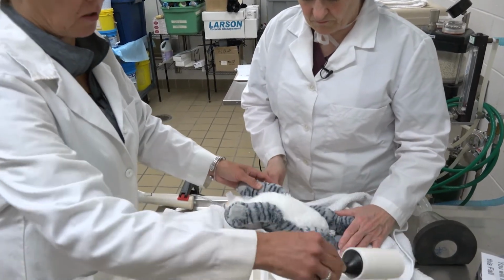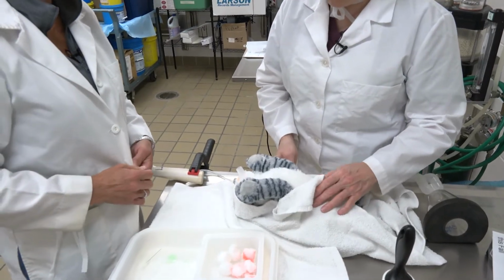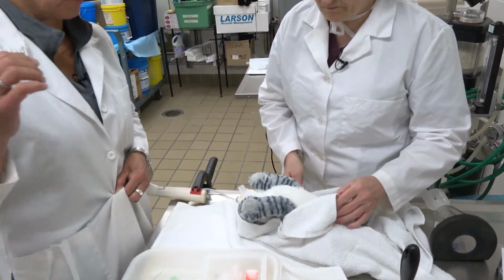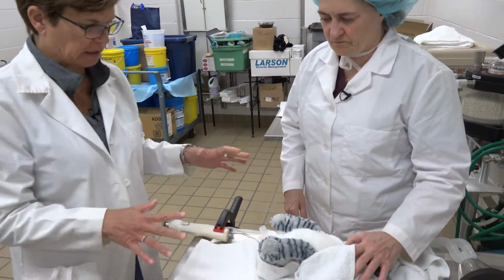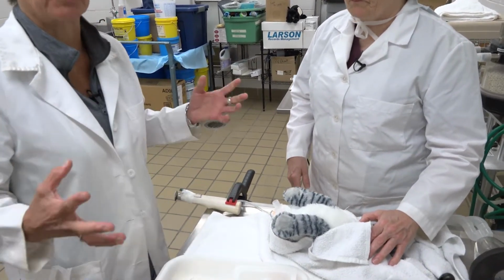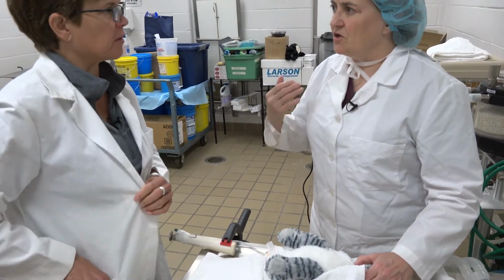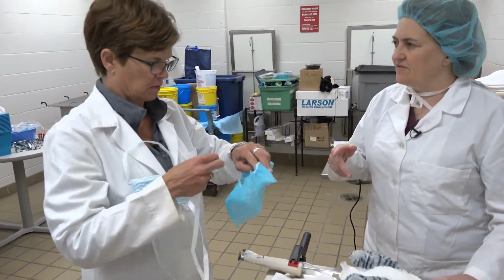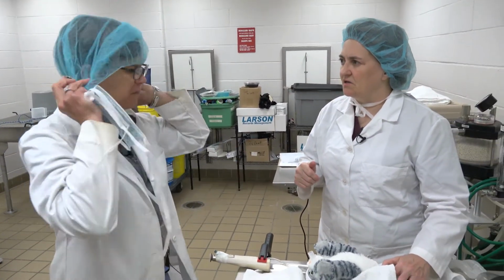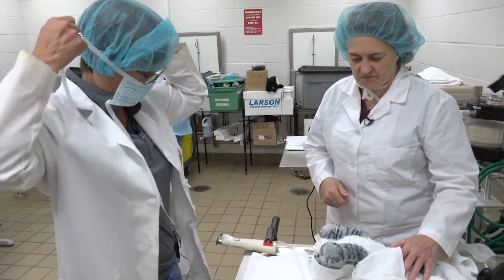We're also going to take our lab coats off at this point because they are hairy from shaving, and we're going to put them in a locker. So again, one person's going to need to stay with the patient. The other person can clean up our catheter supplies while the others are getting their lab coats off and bringing the animal into surgery. Sally, of course, I'm going to put my cap and mask on too. Yeah, put your cap and mask on, and I'll clean up everything while you take our kitty in, okay? Sounds great. Sounds good. We'll get anesthesia started. Sounds good.